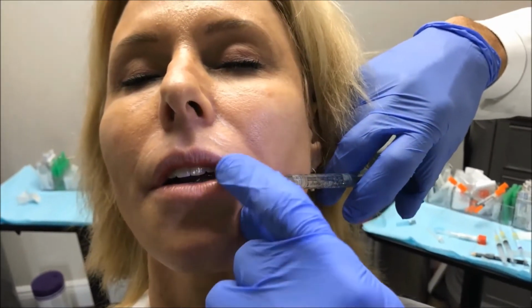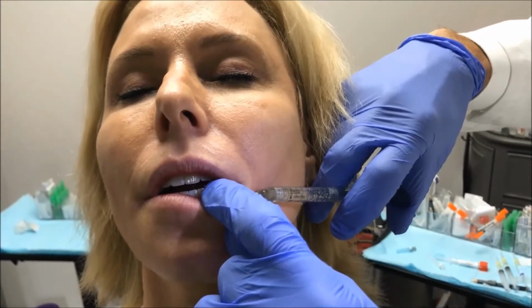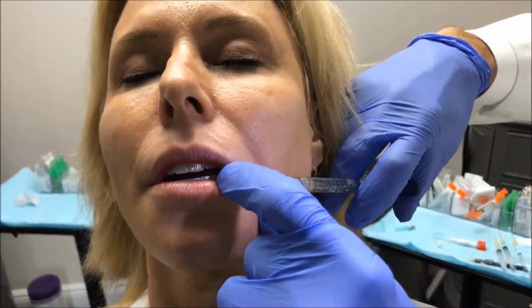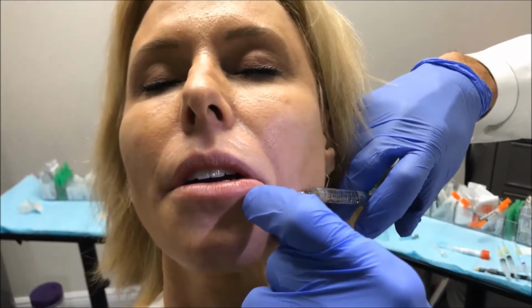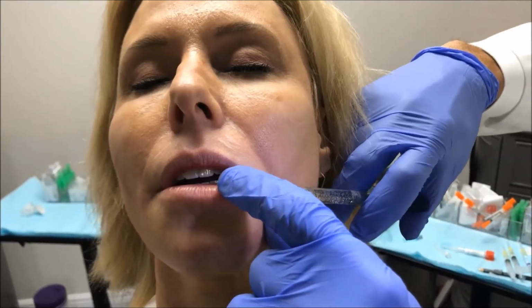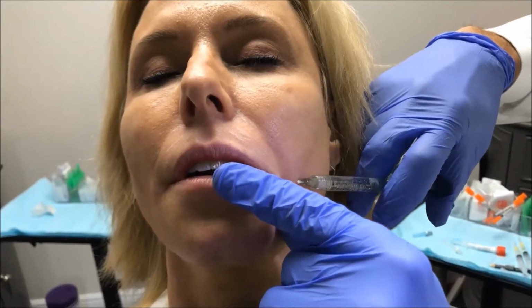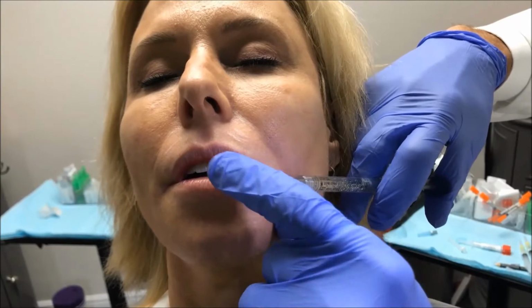Now I'm injecting a little bit of Juvederm just to provide a little bit of subtle volume for the lower lip without really overdoing it. And again, a little safer technique with the micro cannula.